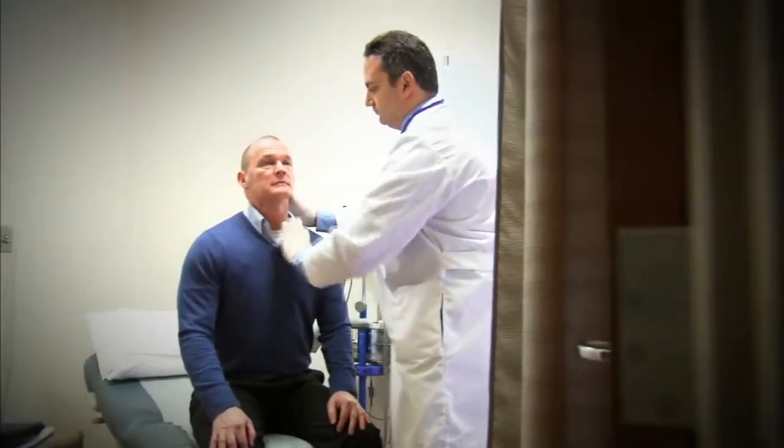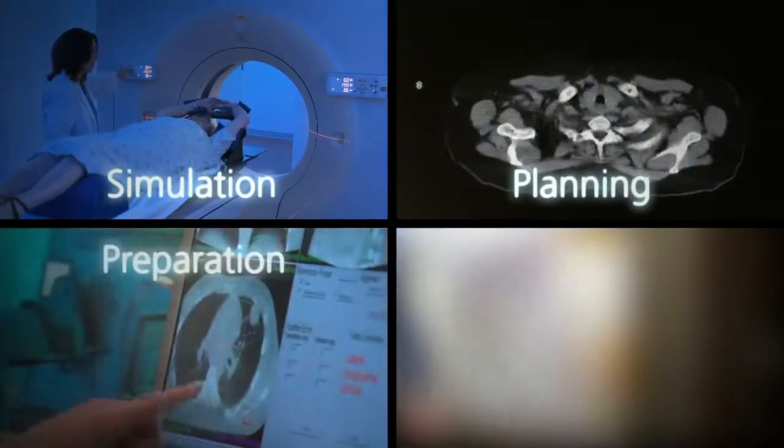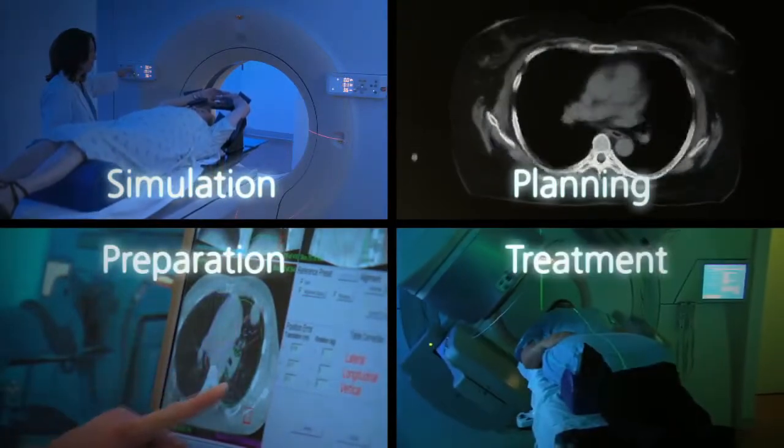Your radiation treatment process consists of 4 basic steps: simulation, planning, preparation, and treatment.